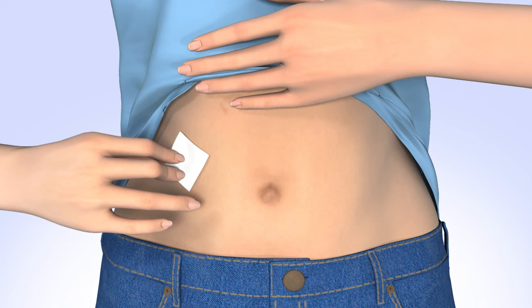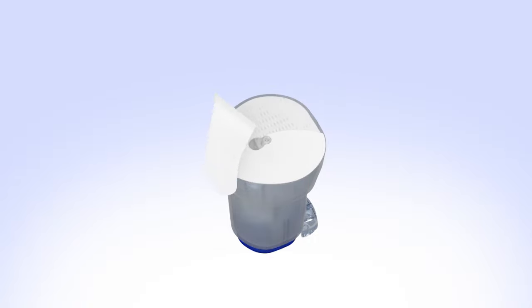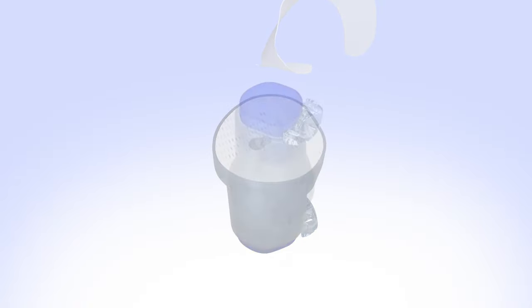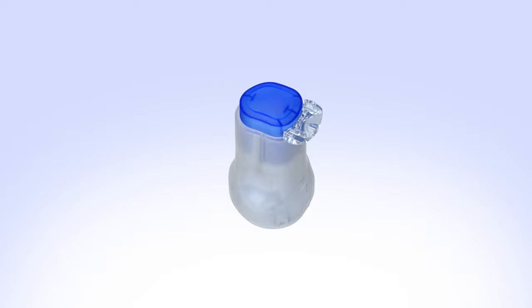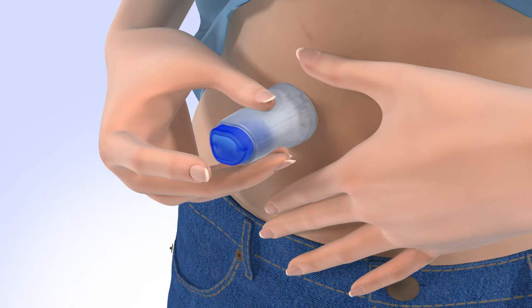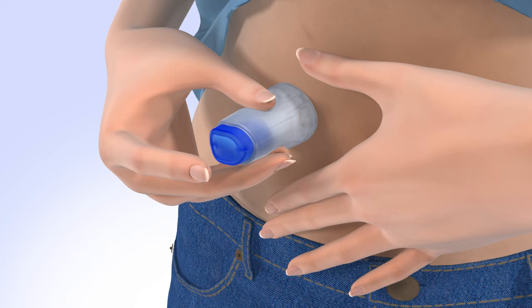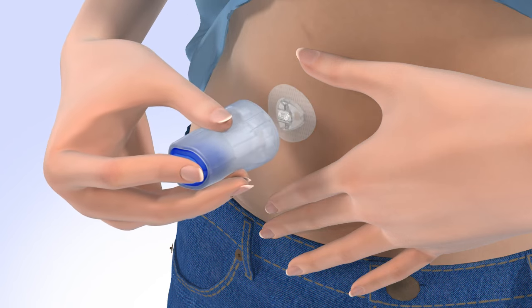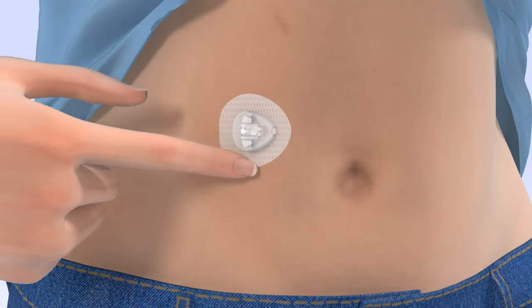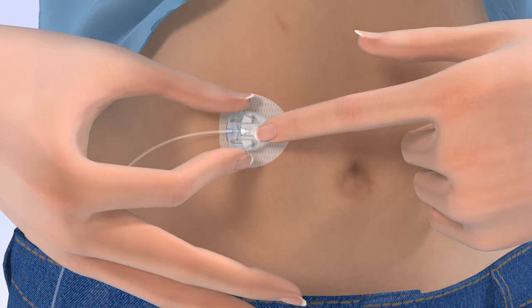Clean your infusion site properly with an alcohol wipe or prep wipe. Allow your site to air dry. Pick up the insertion device and remove the paper backing, being careful not to touch the adhesive. Remove the disconnect cover by gently squeezing the sides and pulling it away from the insertion device. Store the disconnect cover for later use to protect the cannula housing when disconnected. Stretch the skin until smooth. Place the insertion device on the site that you have prepared. The raised arrows indicate the side where the tubing will be connected. To insert, firmly press the top button. Carefully pull the insertion device away from your body. Smooth the adhesive onto the skin. Hold the cannula housing steady with your finger, then push the site connector straight into the cannula housing until you hear a click.